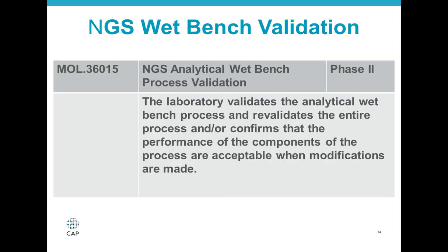The next item from the molecular pathology checklist regarding next-generation sequencing wet bench validation requires that all next-generation sequencing laboratories validate their analytical wet bench processes and then revalidate these processes when modifications are made.